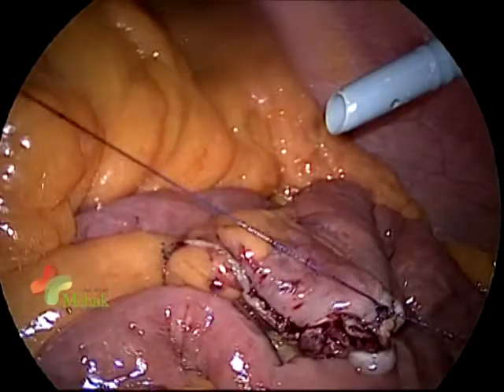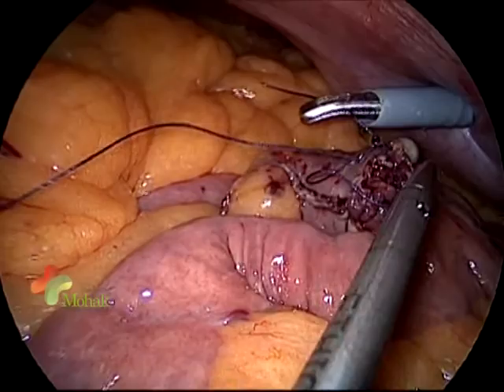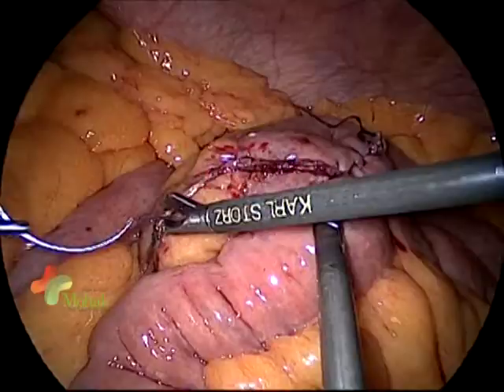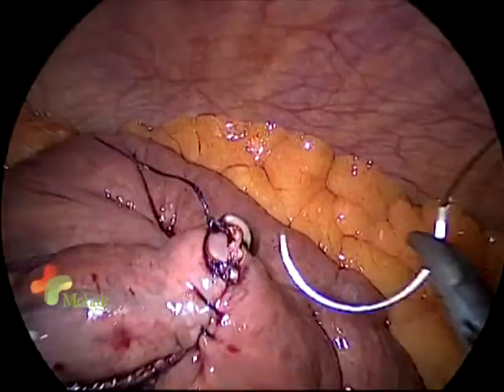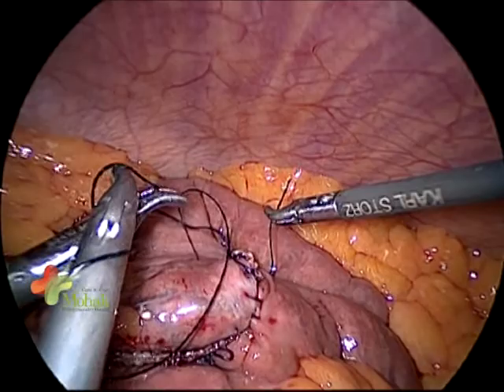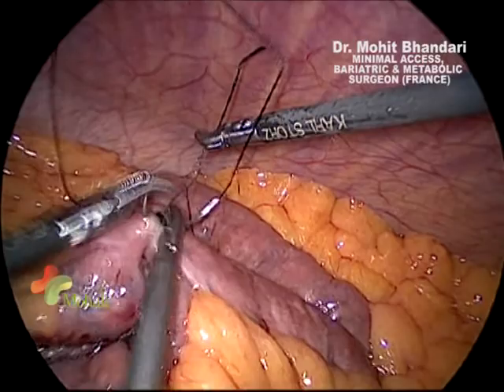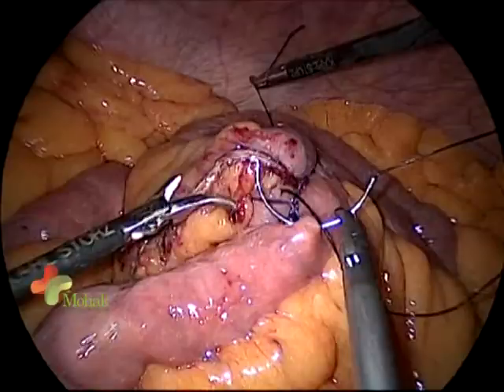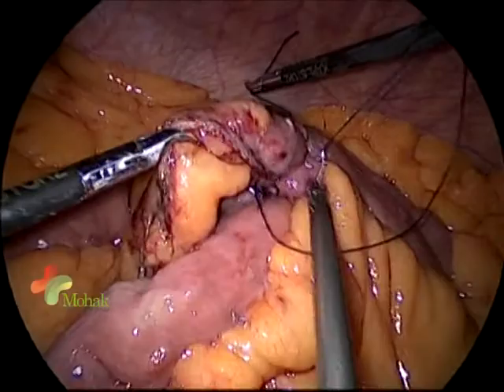Once the defect is closed, we first take a stay suture and then close the defect. The principle is to bury the mucosa in the very first stage when closing, and then take a second layer with silk 2-0. We try to cover every defect with a second layer. This is the safest anastomosis technique because it mirrors open surgery — there is no gap and there is good serosal cover, making it very safe and hemostatic.